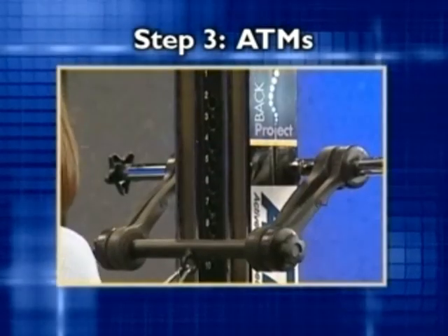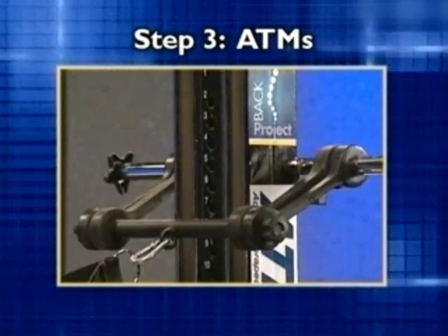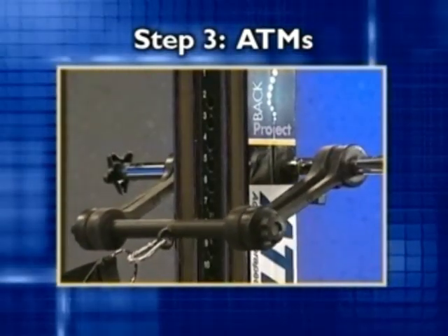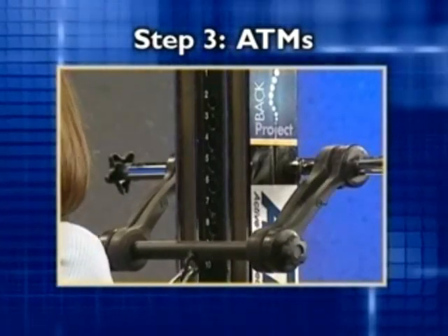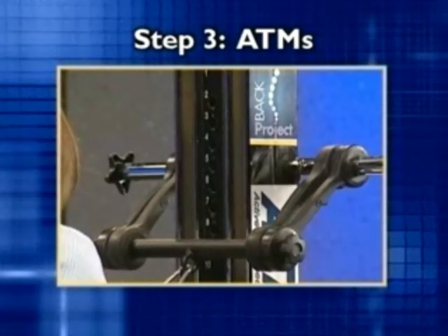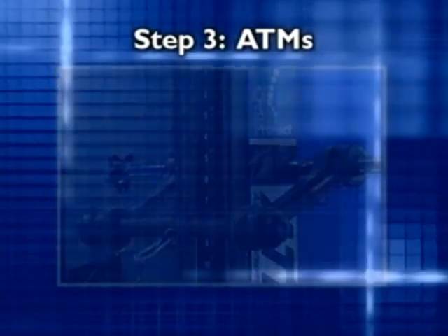Resistance to ATMs is provided by relatively stiff elastic bands that have variable resistance options to accommodate the user's current pulling ability. The elastic resistance also ensures that the short-range movement will remain close to the midline.